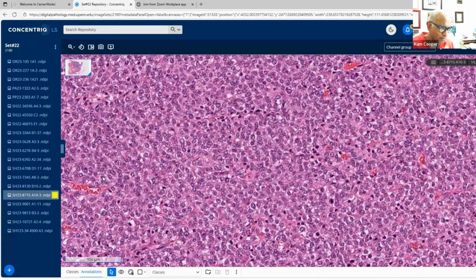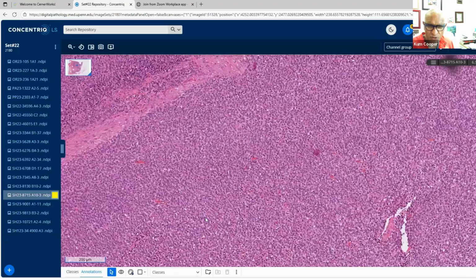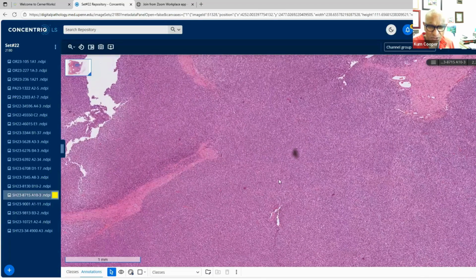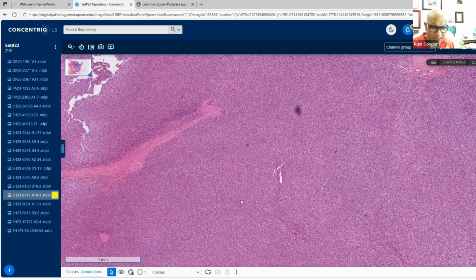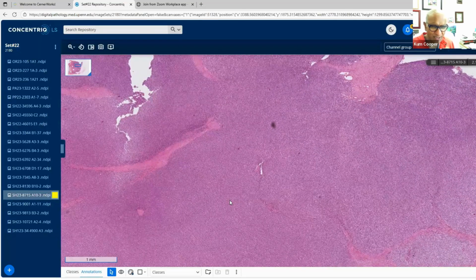Oh yeah, always keep weird melanoma in mind. And again, that was addressed with clear cell sarcoma, because we said that the melanocytic markers were negative in that context. Glomus tumor, that's a very good thought. It's a very, very good thought. You can get glomus tumors that look diffuse. They don't all necessarily show the nice arrangement around vessels, and they can be sheet-like as well.